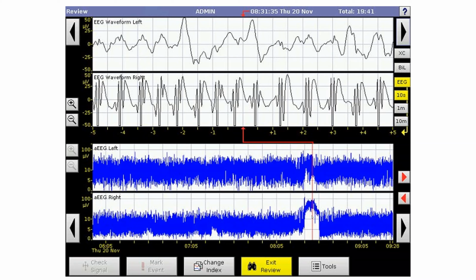Combined with the fact that over 10 microvolts, remember, we move into the logarithmic part of this scale. Now instead of there being only 10 microvolts between here and here, once we're above this line, the equidistance between these two lines is 90 microvolts. So the seizure voltage is high, but it's also in a very narrow bandwidth, in the sense that there's not a lot of variability, which is what causes the shrinking of that.